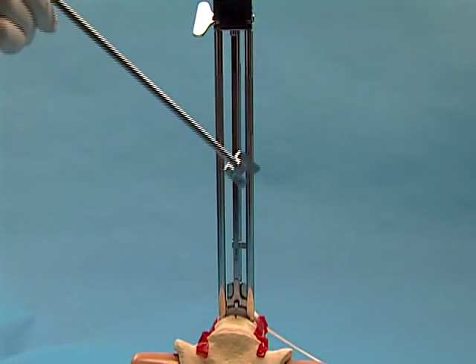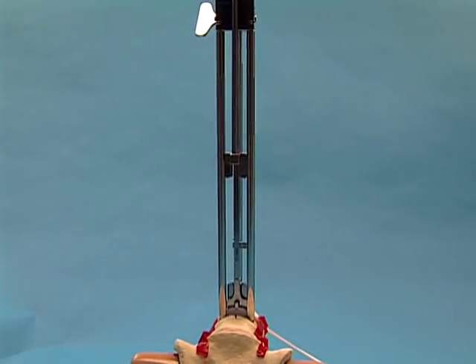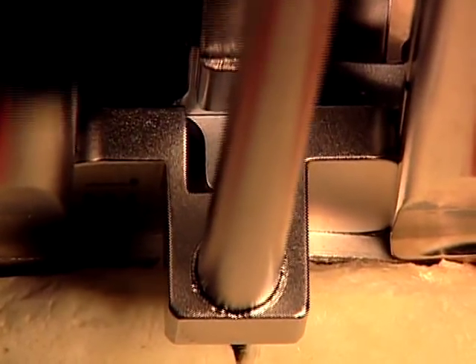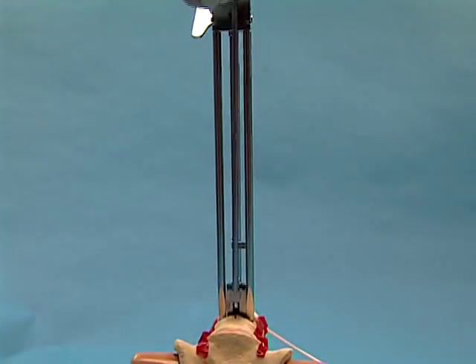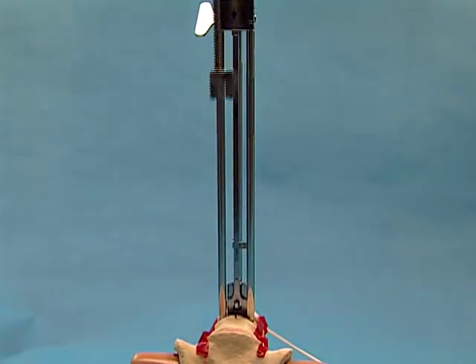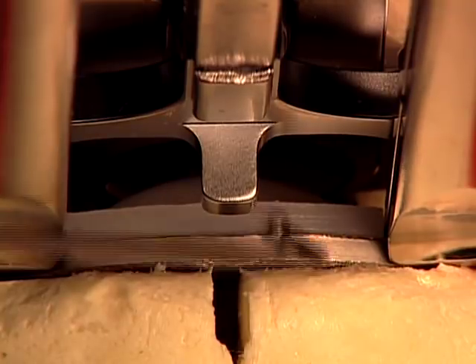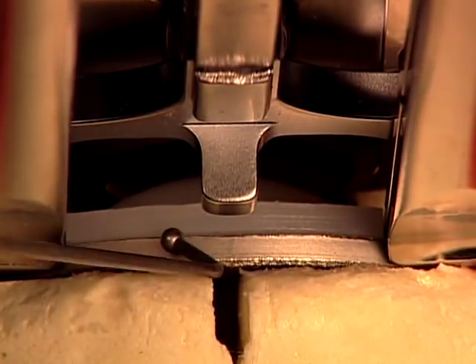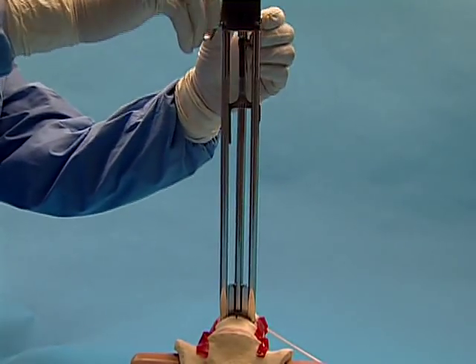Insert the inlay pusher into the same grooves in the inferior arms. Manually push and lock the polyethylene inlay into the inferior end plate. Remove the inlay pusher. Visually confirm the polyethylene inlay is locked into the inferior end plate. Use a nerve hook to verify that no step and no gap is present. Return the distractor to its original position and then remove the distractor from the inserter.